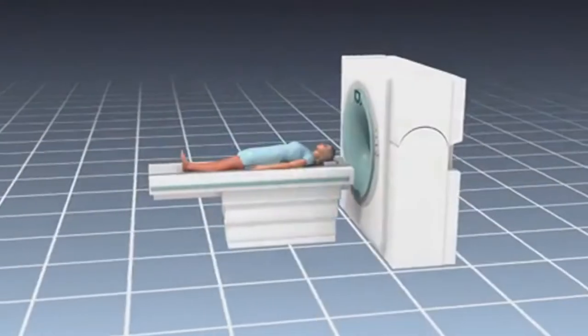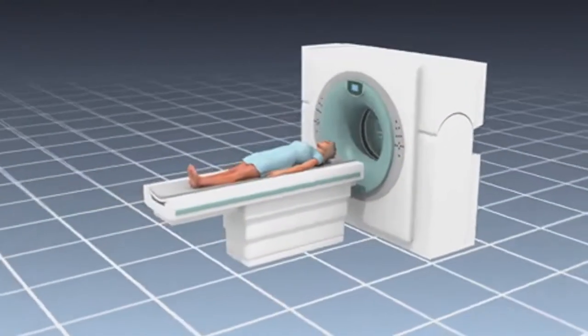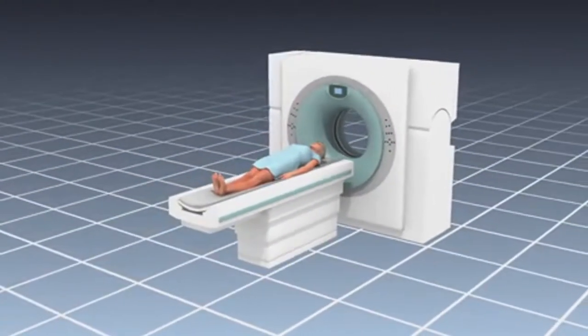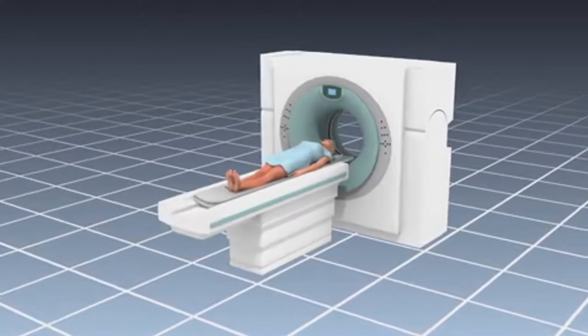It works like this. A patient generally lies on a flat bed that passes through the hollow middle of a device that looks like a giant square donut.